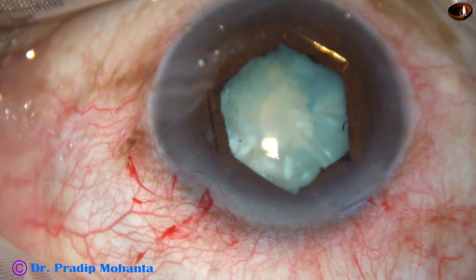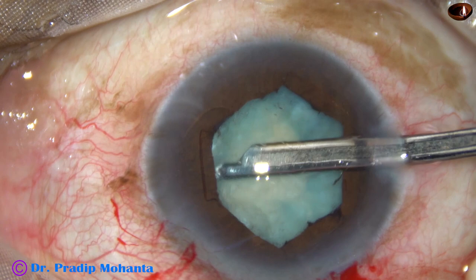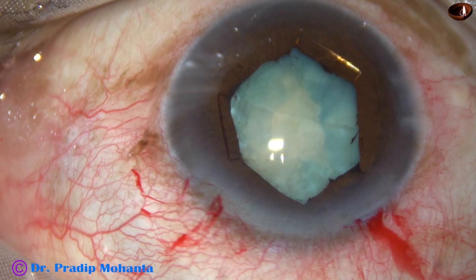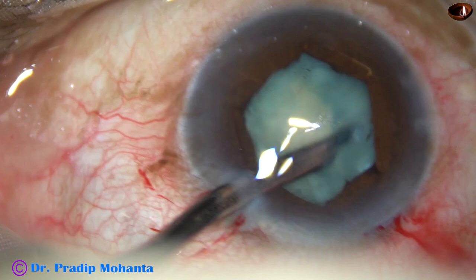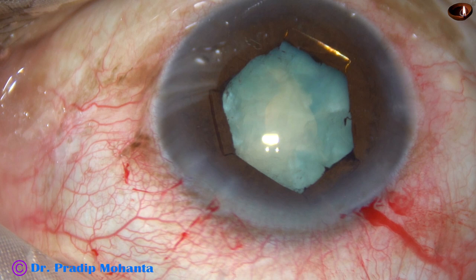Going through the right side port and removing some more cortex from 2 o'clock and 1 o'clock. Then going through the left and removing some cortex from 10 o'clock and 9 o'clock. The bag is now decompressed nicely and the intralenticular pressure has decreased significantly. Visco is injected.